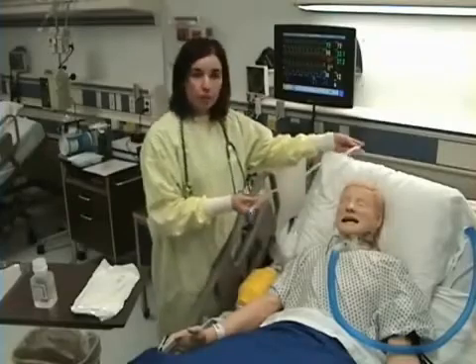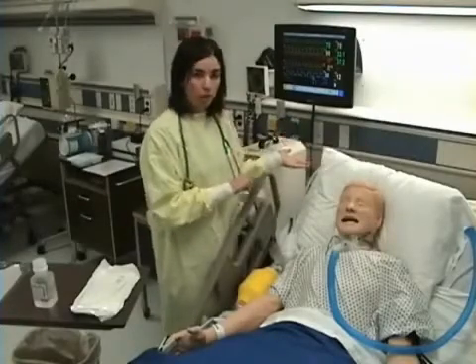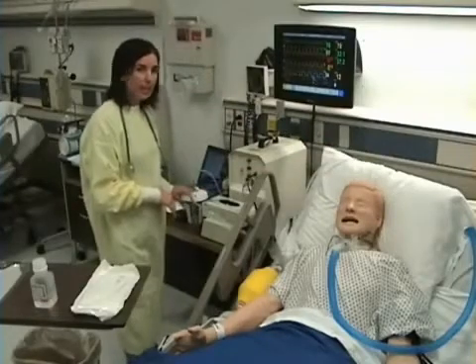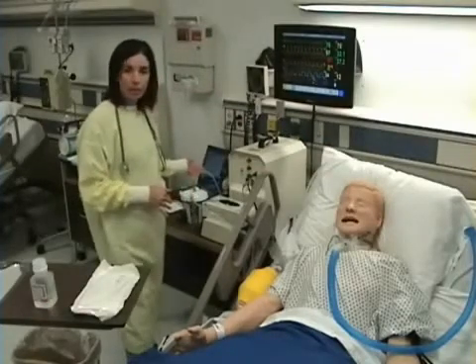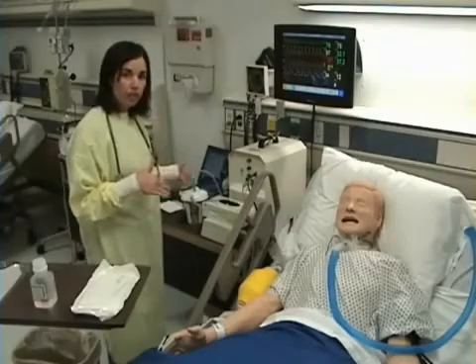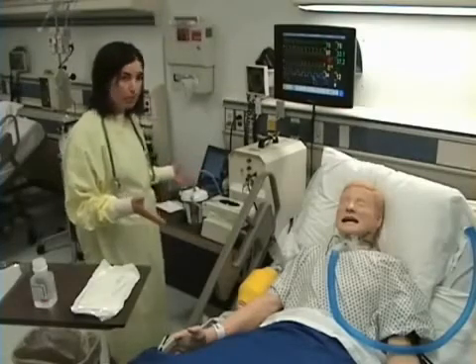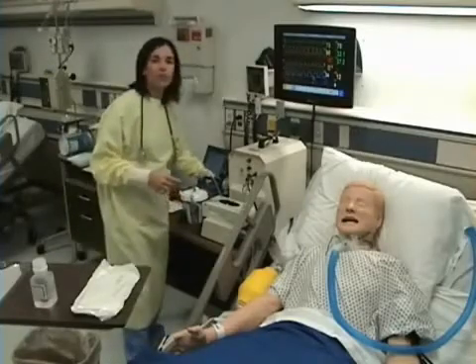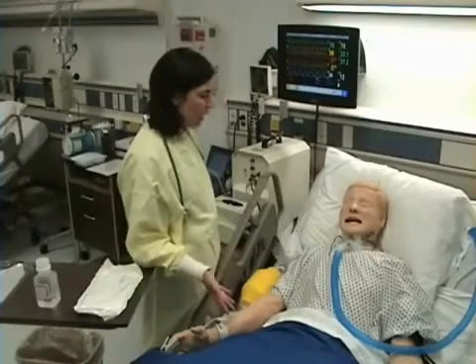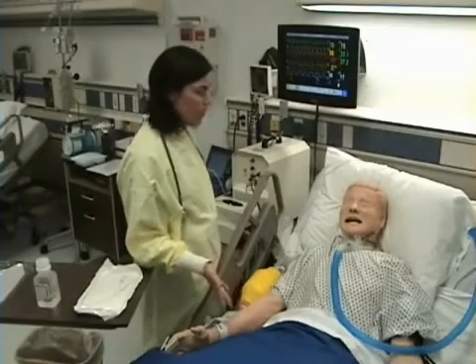You also need to have workable suction, either via a wall unit or portable suction. I have portable suction today. You want to turn it on and make sure that it's working correctly. The limit should be from 100 to 150, or check your hospital policy. I'm going to explain to my patient what I'm going to be doing, and I will get started.